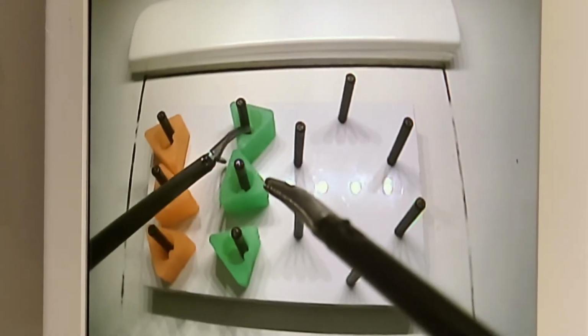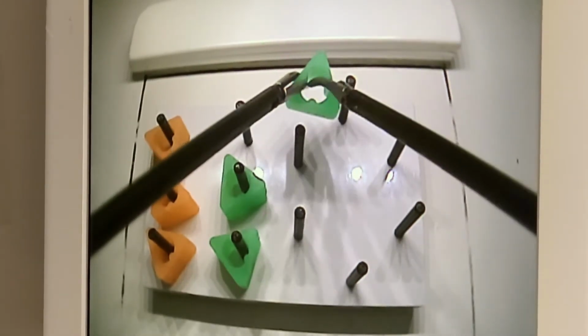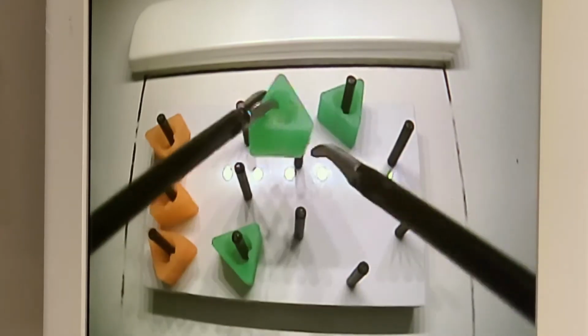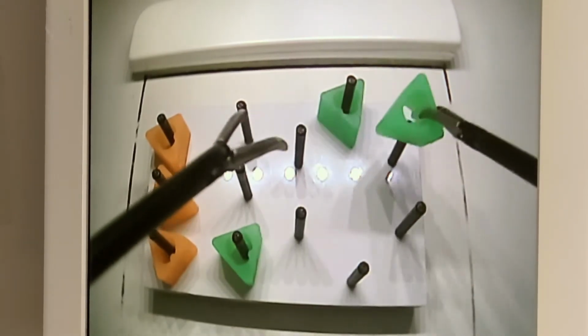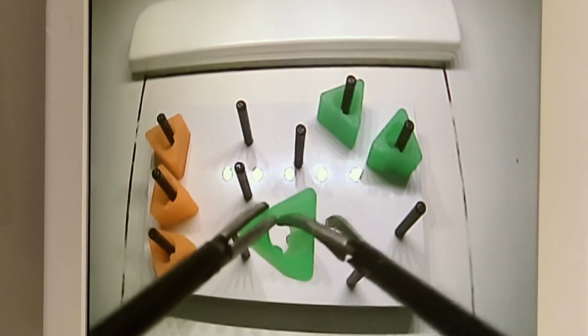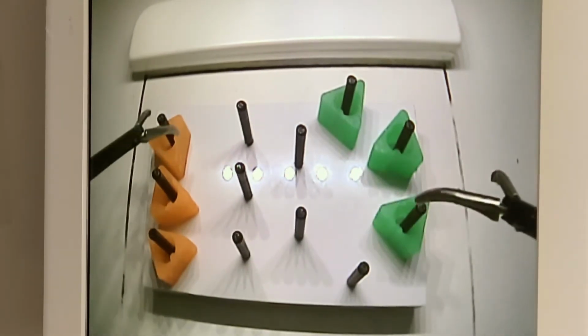Task 1, peg transfer. The purpose of this task is to orient you to working in a 3-dimensional environment, but seeing 2-dimensional on the screen. To complete this task, you will move the 6 triangle blocks from one side to the other and back.